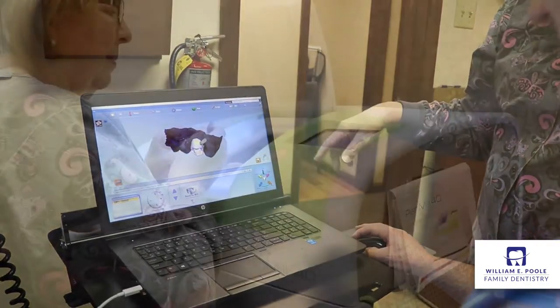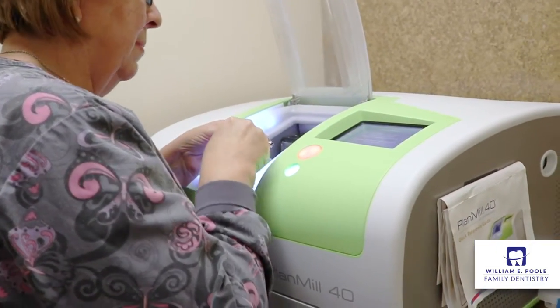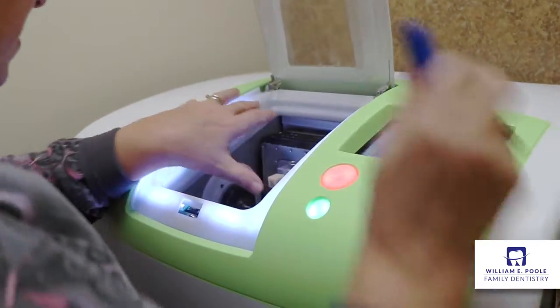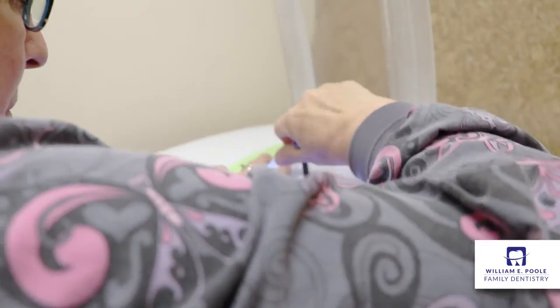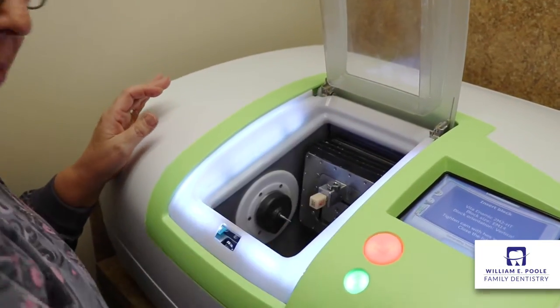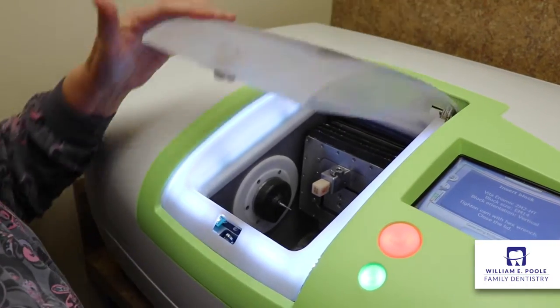The crown is basically going to be made out of a combination of ceramic and polymer. It's a combination of the two that allows proper flexing so that it replicates a natural tooth. We place a solid block of this polymer and ceramic into the milling machine, and we have a series of diamonds that mills to the exact specifications that we design on our software.